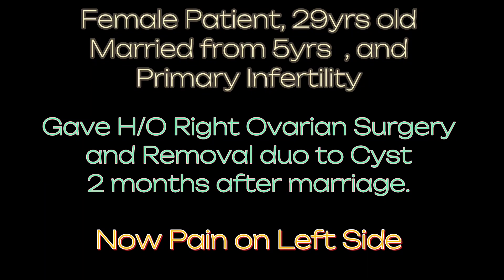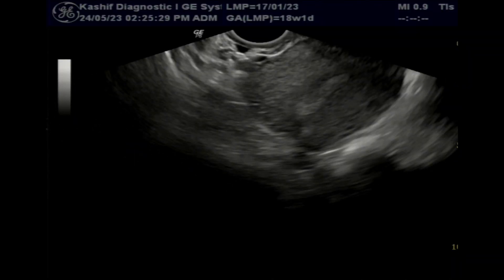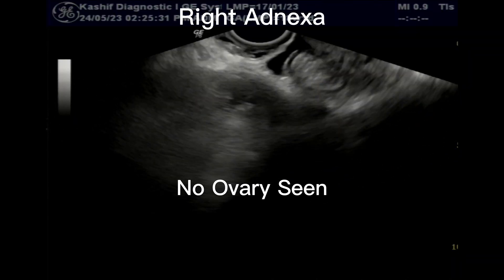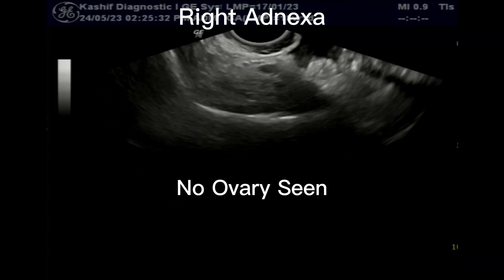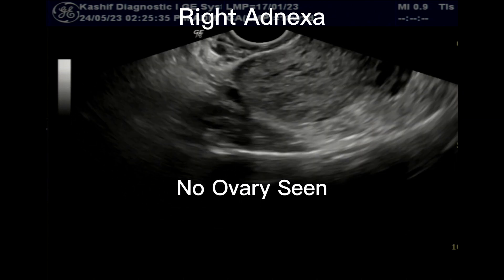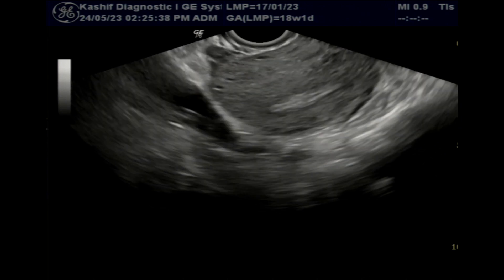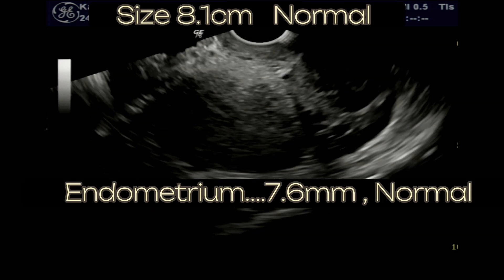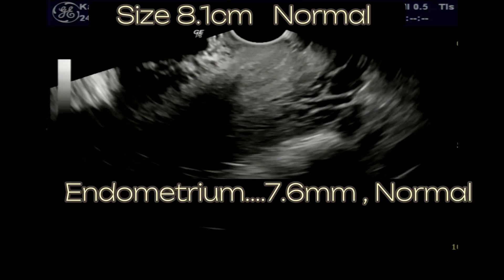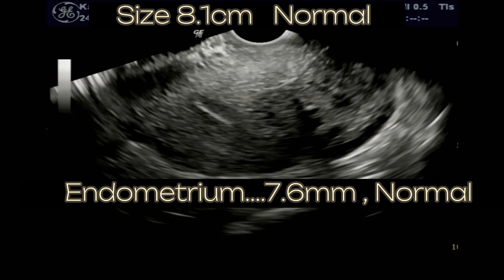This is a female patient, married for 5 years with primary infertility. This is a special case because the patient gave a history of surgery immediately after marriage. That was a ruptured ovarian cyst and the right ovary was removed. So this patient has only a single left ovary remaining.